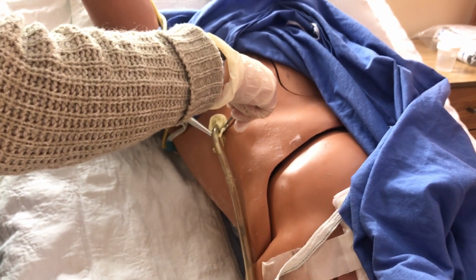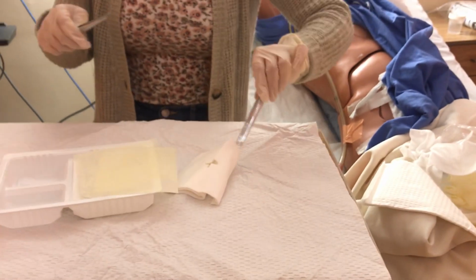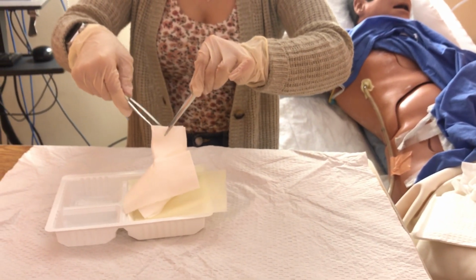And I've cleansed this site, so it's okay if my forceps touch it. And then I'm going to grab some of the drainage sponges here and apply them in 2 different directions.